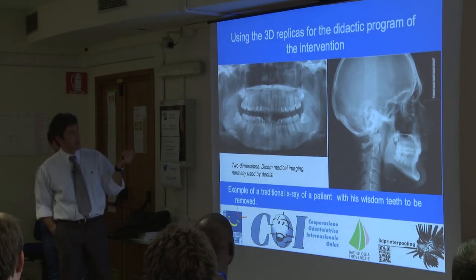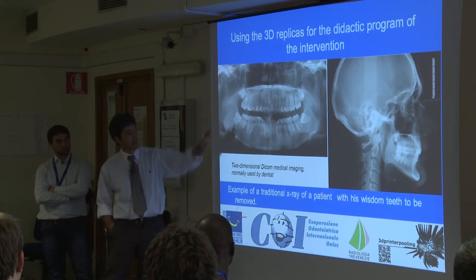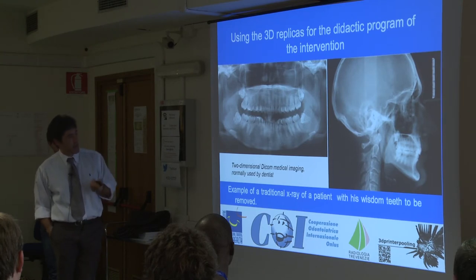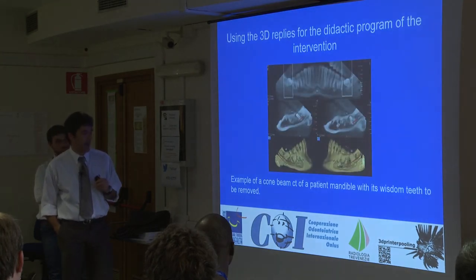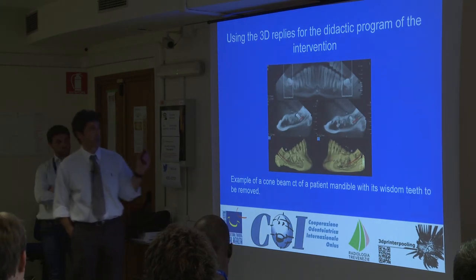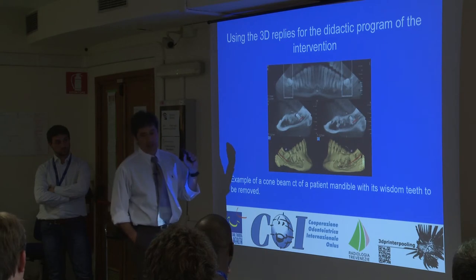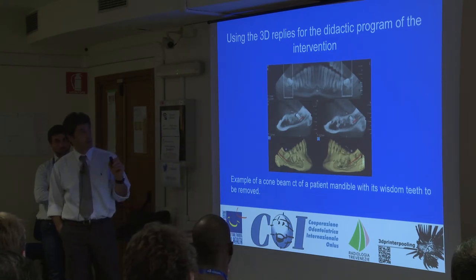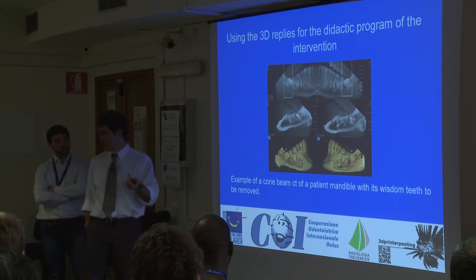You have not yet seen these images. If I have to remove these teeth, I get some information from two-dimensional DICOM medical imaging. But I want more, so I ask for a CT, and I get more information. But it's not easy for me to understand sometimes, and it's very difficult for the patient, or for the surgeon I have to teach.